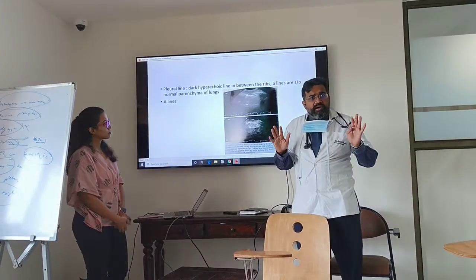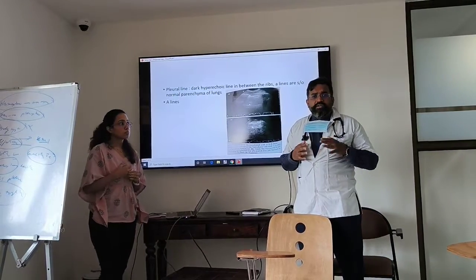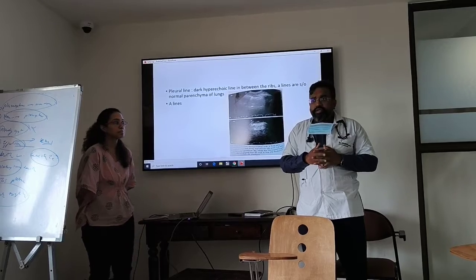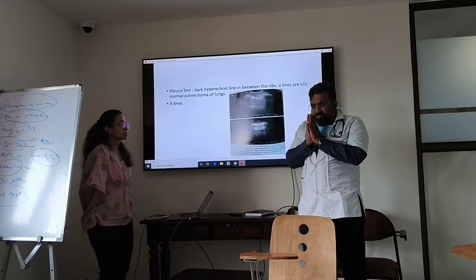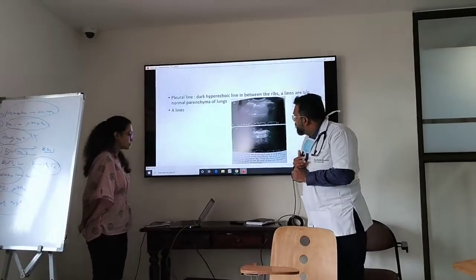Clear on this? Is it clear? I don't want to hear that the patient is very bad and I can see A lines and B lines. I don't want to hear that, because A lines are normal. Okay, don't worry. It's a reverberation artifact.